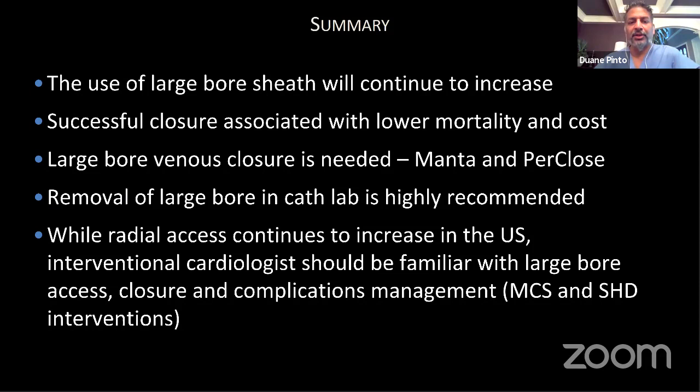You're going to be using more large bore sheaths as we do more and more complicated cases, and if you're participating in structural procedures. So one shouldn't forget the deleterious consequences of vascular access complications. There's a substantial increase in mortality if a patient has a large bore access bleed, and it often is the method or means for the beginning of a spiral of complications in our patients who are on ECMO or impella support or from TAVR. So it's very important to be very meticulous about this type of access.